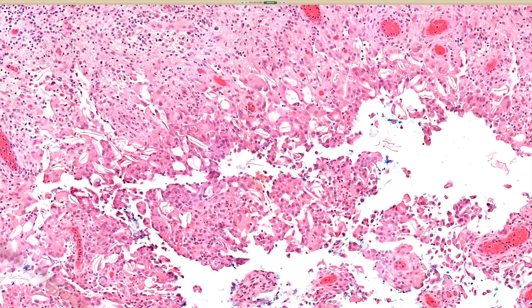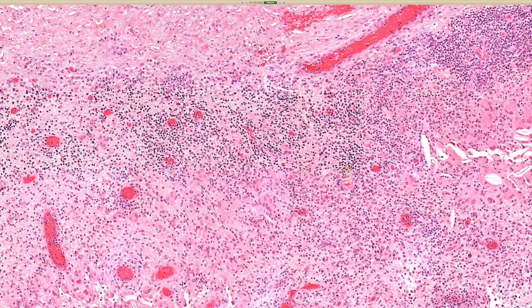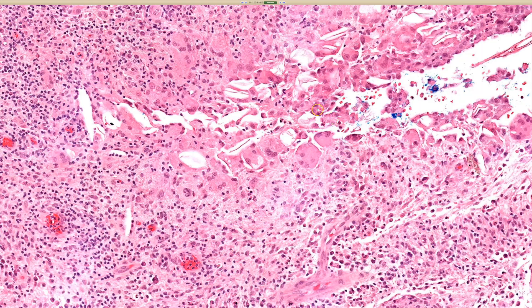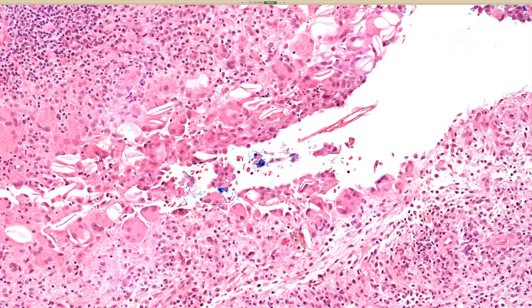Very good. So we've got a granuloma here with neutrophils, lymphocytes, probably going to be eosinophils, plasma cells — all the inflammation. And the key is: why is the granuloma there? That's basically whenever we see granulomas, that's what we want to figure out. Is there a reason for the granuloma to be here?